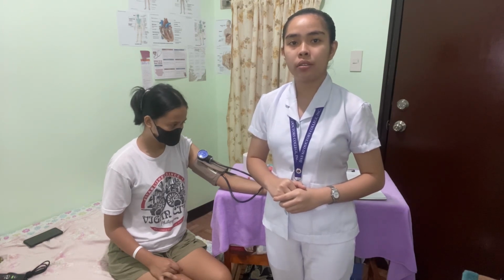So now I have already taken her estimated systolic pressure, which is 110 millimeters of mercury. So for the actual, I'm going to take her blood pressure. I'm gonna need to inflate the cuff about 30 millimeters of mercury higher than the estimated systolic pressure. This is to avoid missing the auscultatory gap, which is the temporary disappearance of the Korotkoff sound while deflating the cuff.